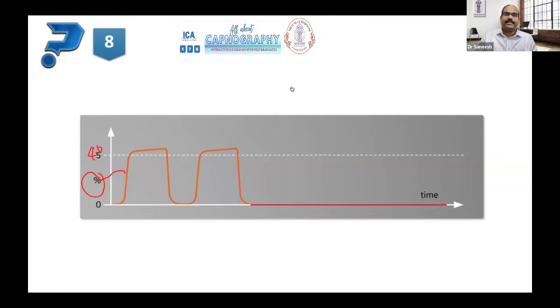Anything else can cause a sudden drop to 0. Pulmonary embolism. Yes, sudden cardiac arrest, pulmonary embolism, but it may not happen like this all of a sudden. Very next breath, it may not drop to 0. That's a point in favor of your disconnection theory.